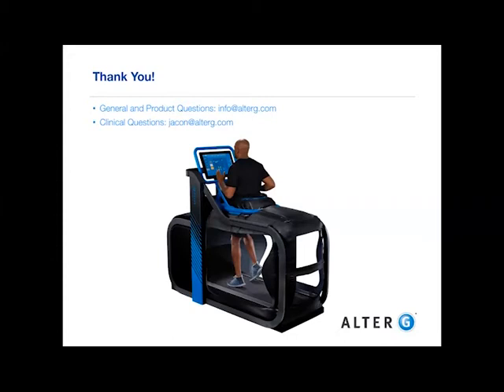Another consideration is girth. If someone is above a certain girth, they're not going to be able to fit into the cockpit. And then the treadmill has a weight limit to it. So you can't load someone that's too heavy into the AlterG because the treadmill won't support that.